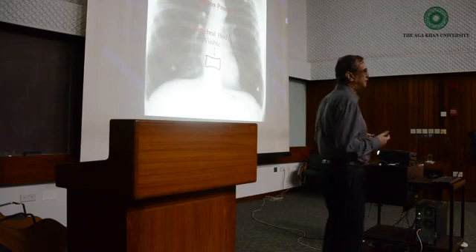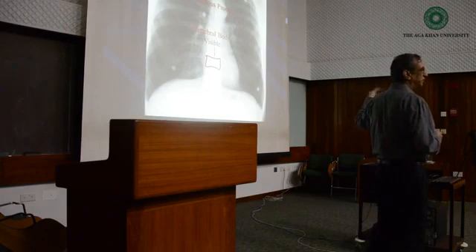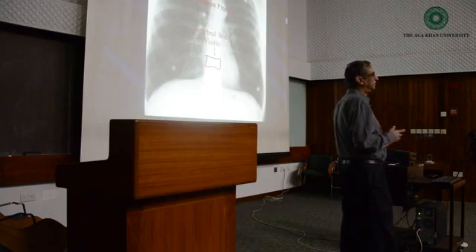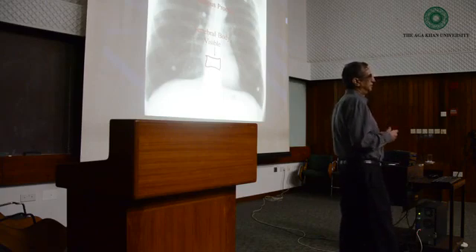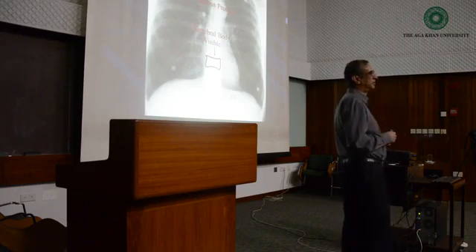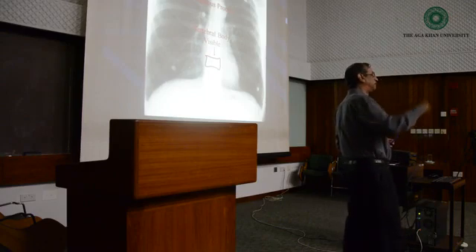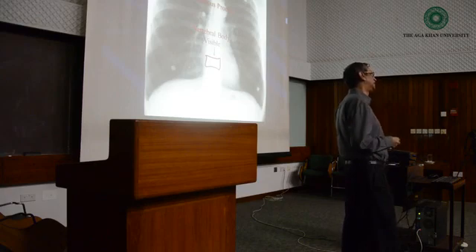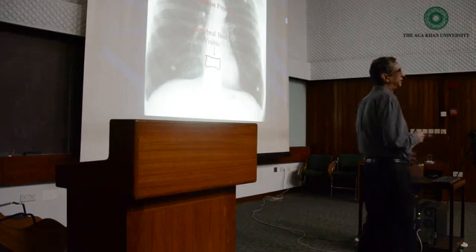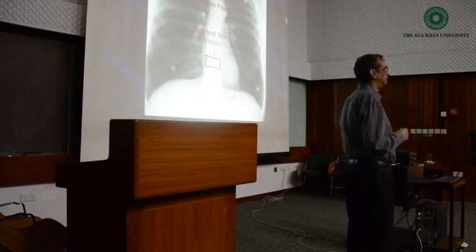If the technologist gives too little radiation, then too little passes through the body and too little reaches the film. That would be an underexposed film. It would be a whitish sort of film. The soft tissue and bone would look almost the same. Have you understood? It's the setting. X-rays have to be set. If it is a child, the technologists will have different settings. And if it is an adult and someone very obese, then the setting would have to increase for that person.